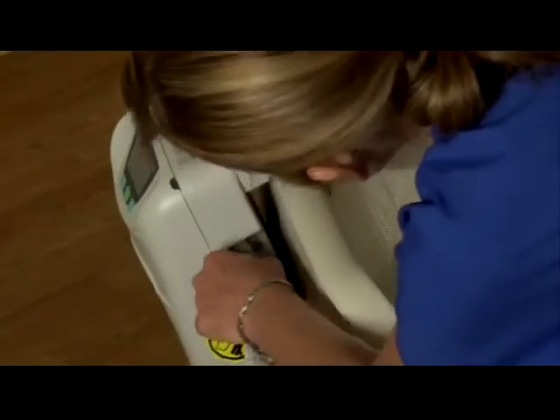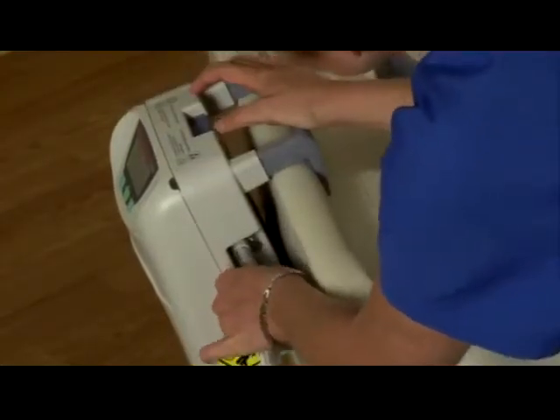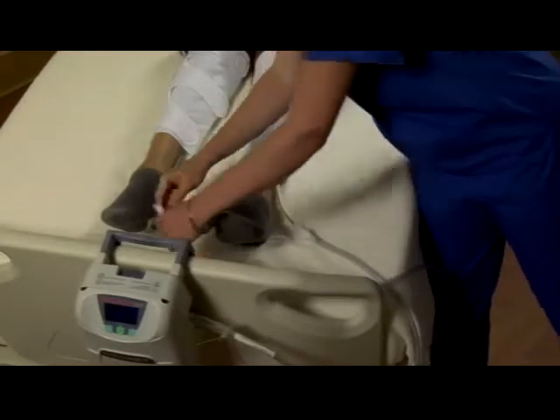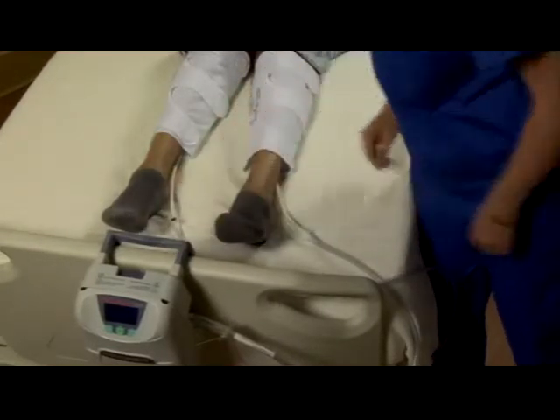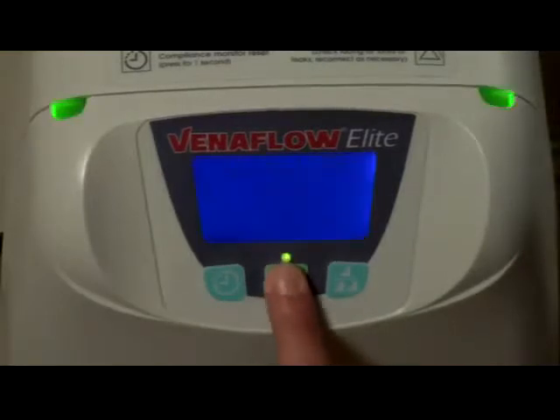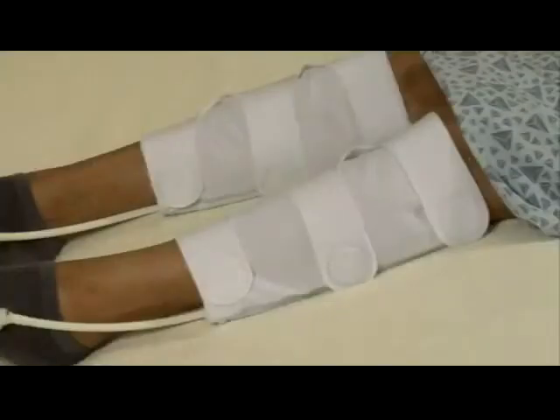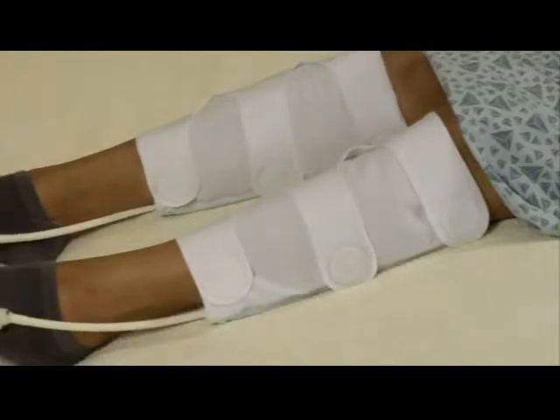The third step is to connect the system. Attach the tube assembly to the pump on one end and to the cuffs on the other. Make sure the connectors click securely together. Then press the green on-off button to power on the device. The cuffs will fill instantly, inflating the distal air cell first.